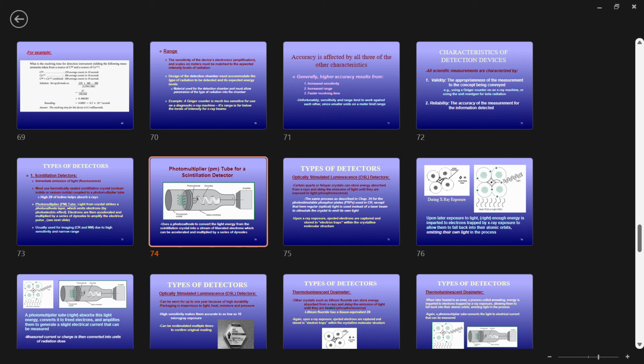I had an inspector come into the office that I no longer work for, but somehow still get to go help with their X-ray room. So I had to go and hang out there and deal with the state inspector. He took his detector, this scintillation detector, and used it under the X-ray tube to measure the beam. Then he took it outside of the room, and we made exposures in the room, and he measured if there was any radiation leaking through the lead walls and on all sides of the room. On one side of the room we have an area where we do our drug screens, a partially occupied area.